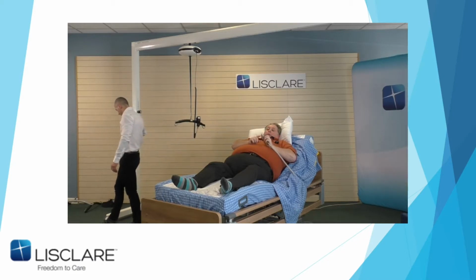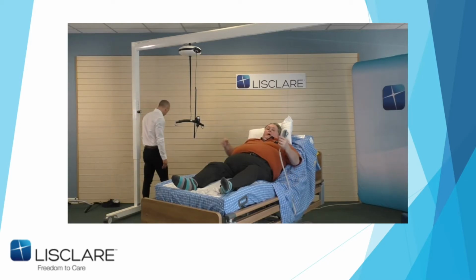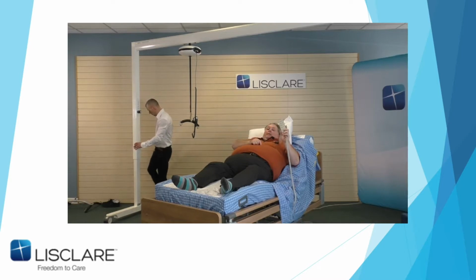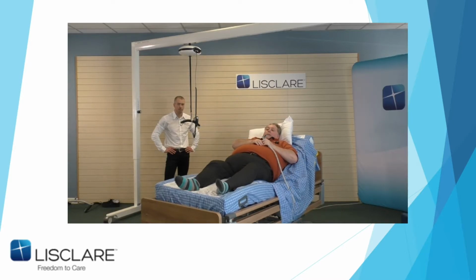Just to explain quickly about locking out, you can slide this up against itself, or you can tuck it in. I would normally assess whether or not the client is being left with the handset themselves. If you leave the side rails up, you don't need to tuck the sheet in. You want them to bring it down with them if they do happen to spasm or go down. The reason why I like this shorter sheet is my heels are always on the silk. So therefore, if I'm moving, I'm not doing any friction on my heels.